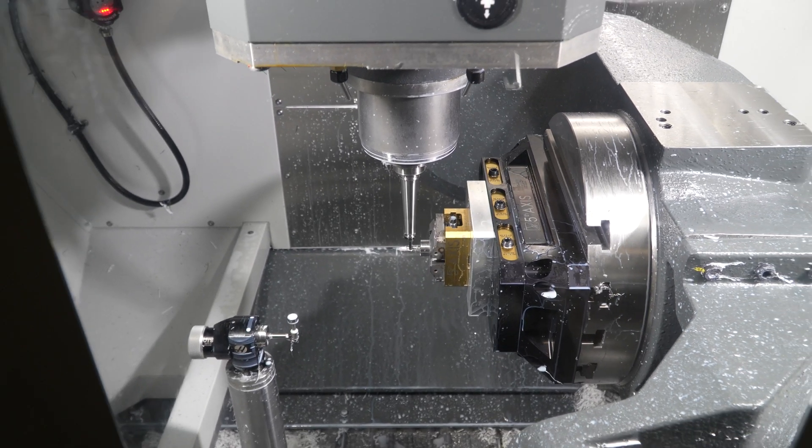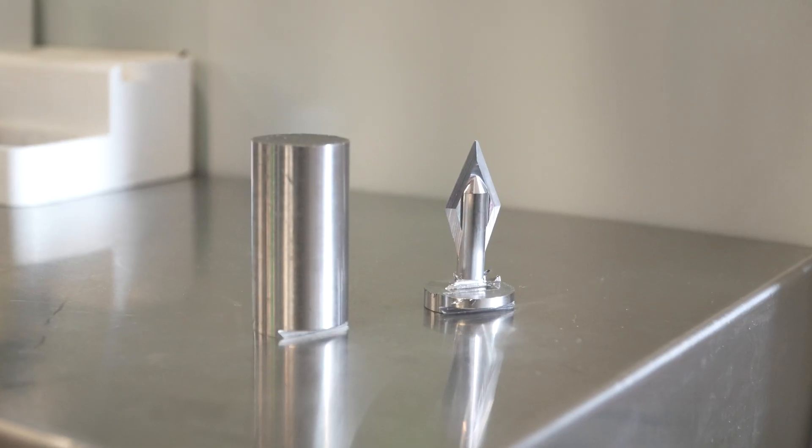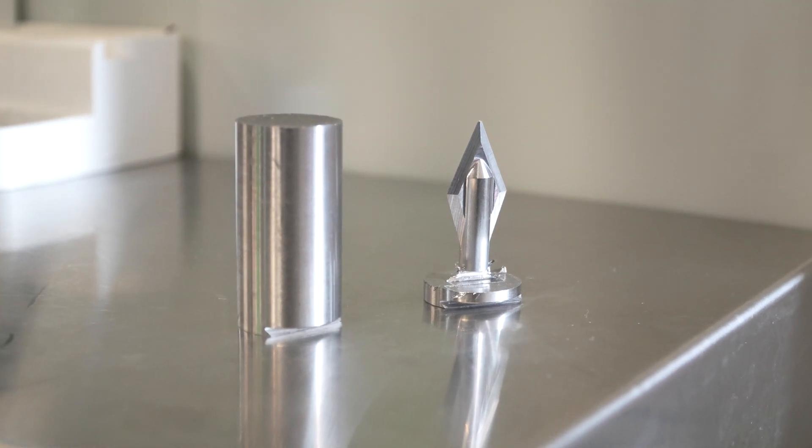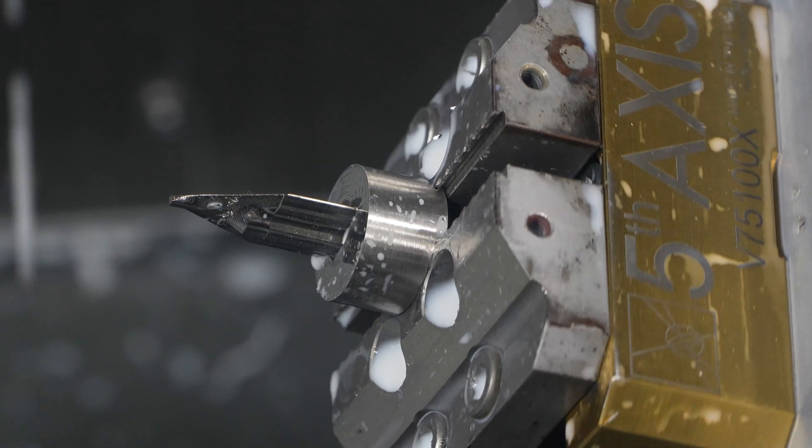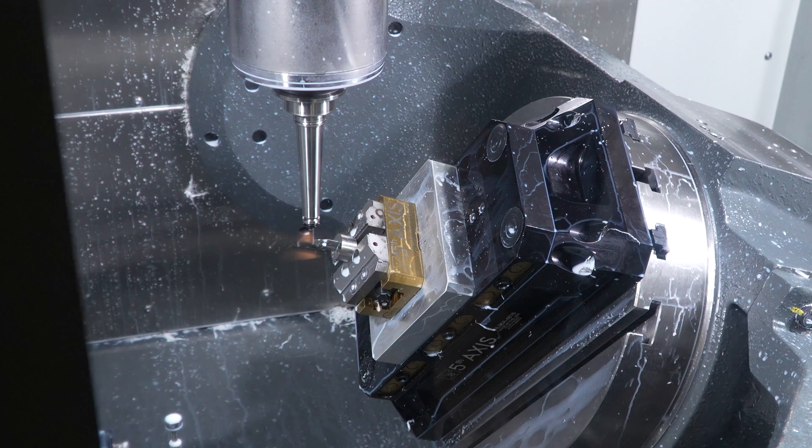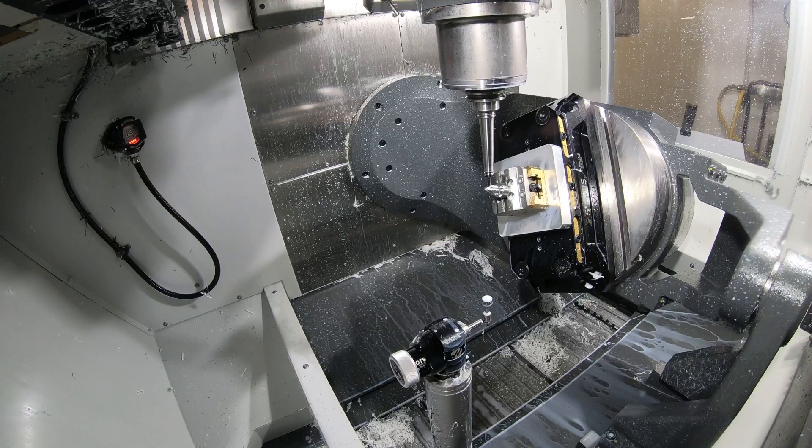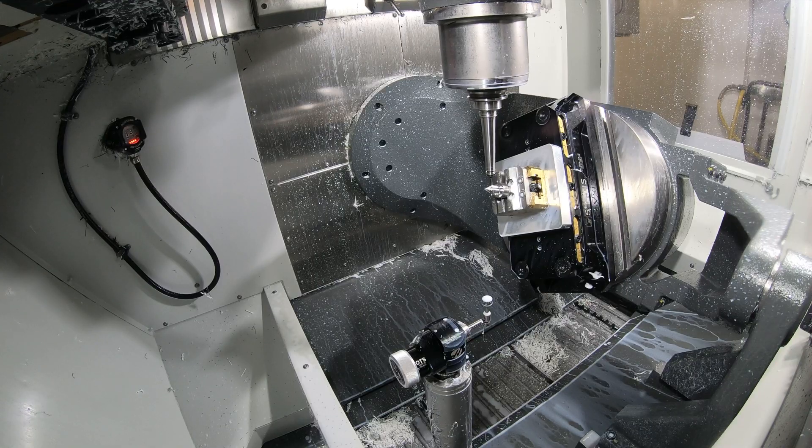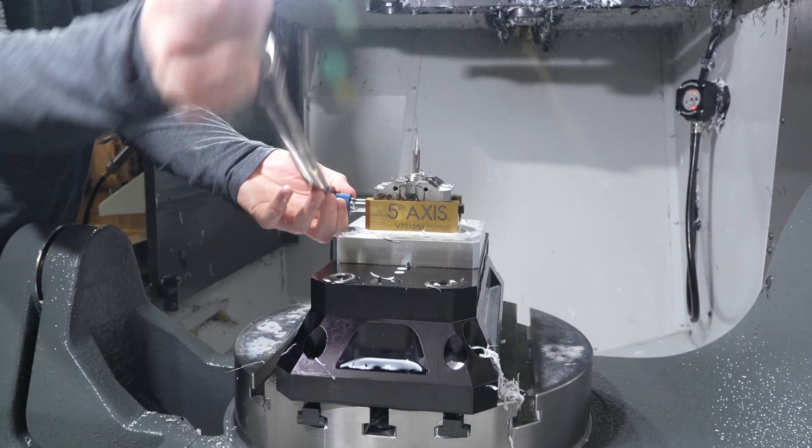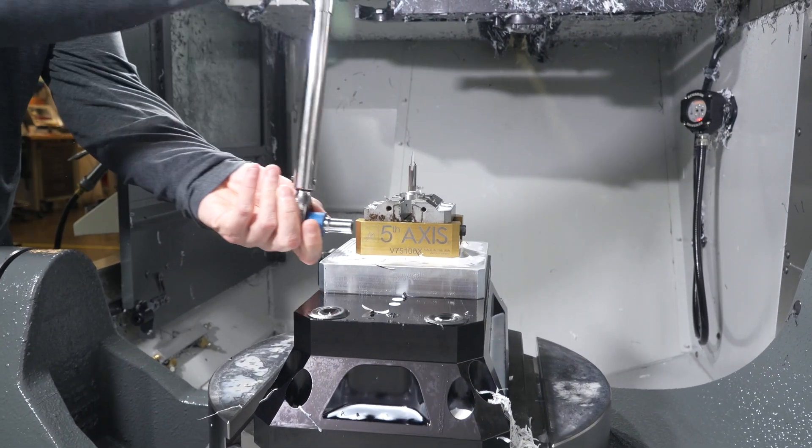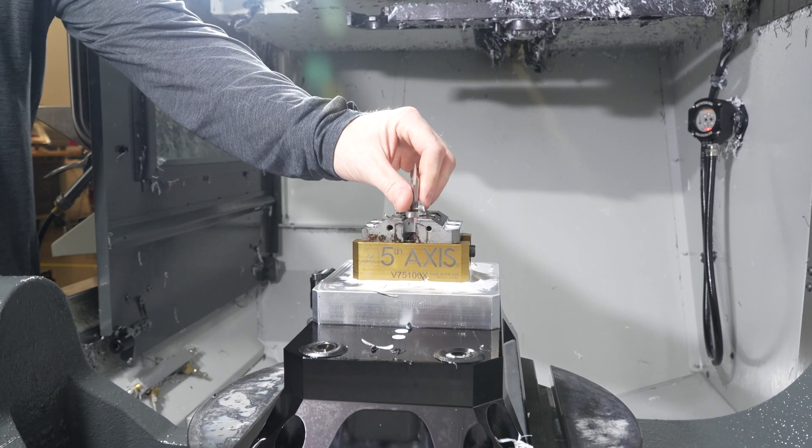The original design of this instrument called for the edges to be ground to maintain a specific level of sharpness. We were able to with the use of our Haas machine tool and our very good talent to come up with a way where we machine those edges complete in the machine and we no longer require the post-process grinding operation. So the part comes off of our Haas mill sharp enough to go into surgery.